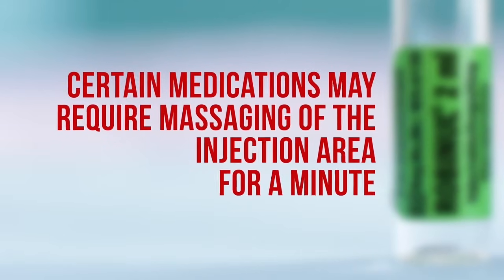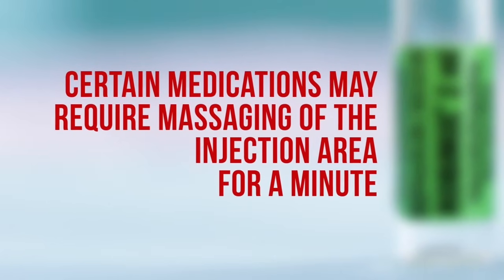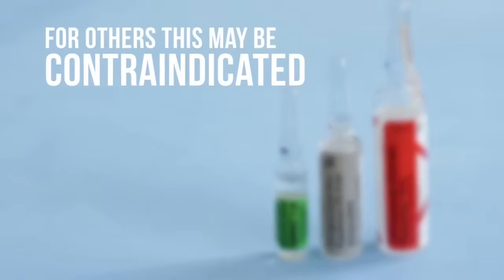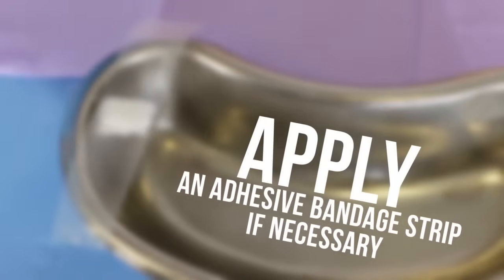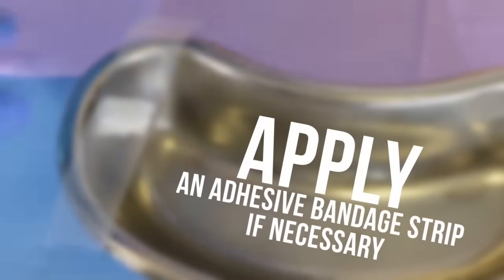Certain medications may require massaging of the injection area for a minute or two, but for others this may be contraindicated. Apply an adhesive bandage strip if necessary.